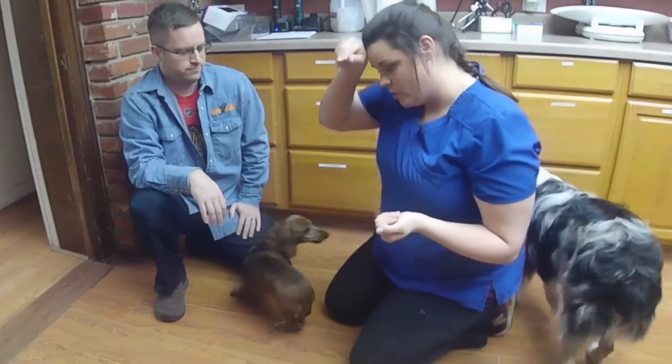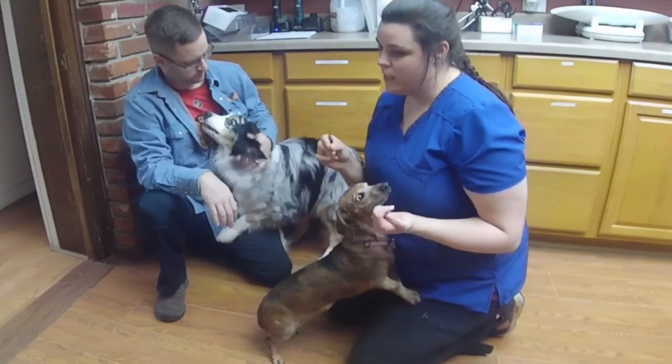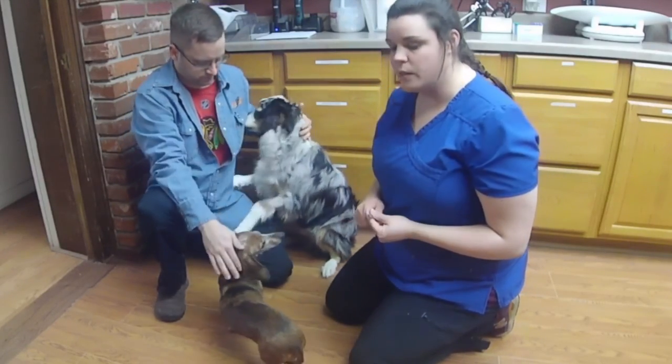They're usually ready to come out. If you have sutures, it's easier to get little hemostats and tiny scissors and clip them out that way.